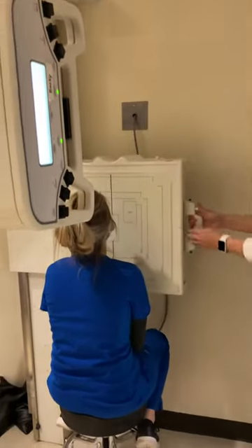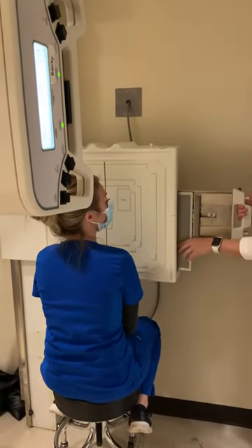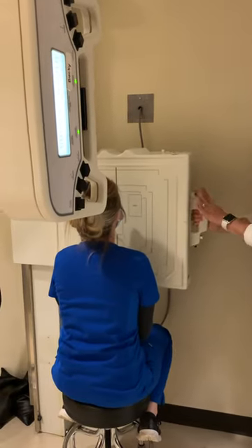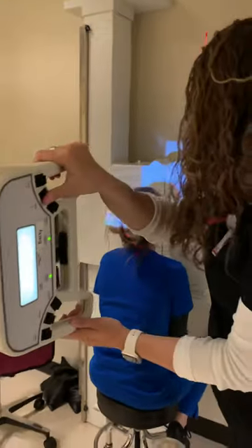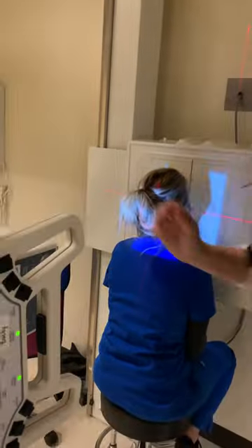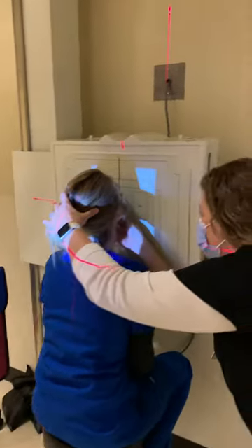We are demonstrating the Waters view, also called the acanthial view, for sinuses. Our patient is erect — they can either be sitting or standing, facing the image receptor.